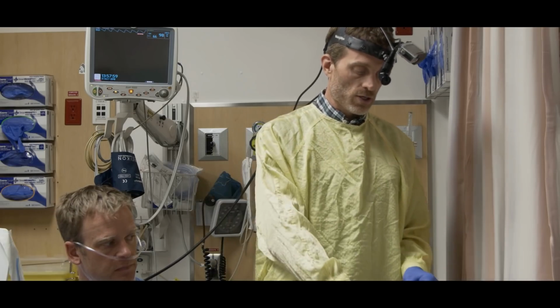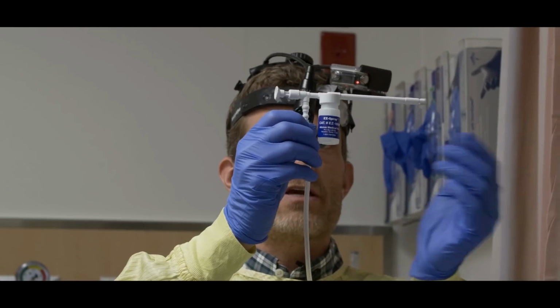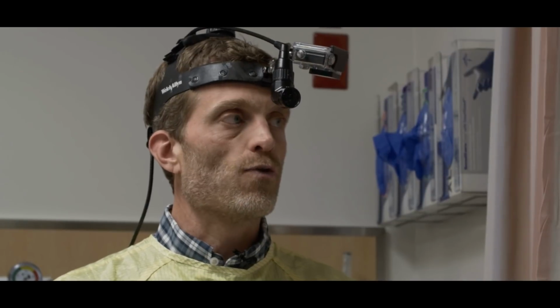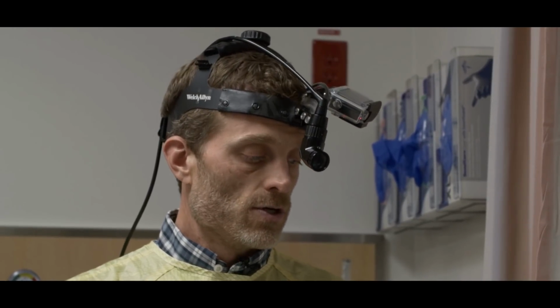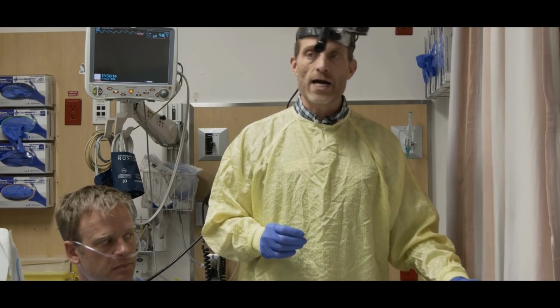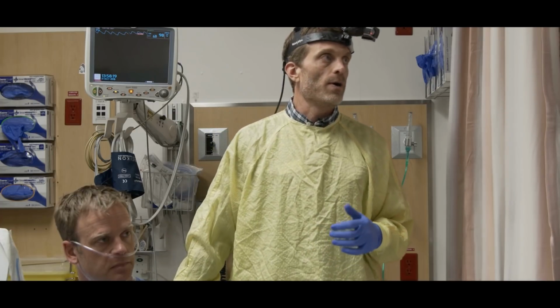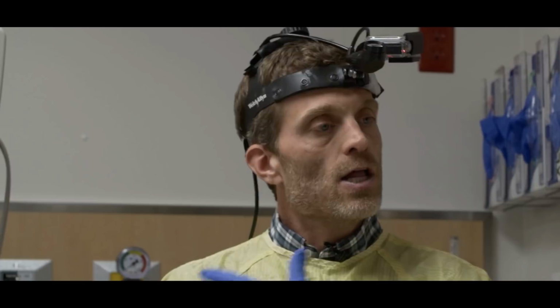And then we used, how much of this did we use? We started with 10, and we have about 6.5 left. So let's say even 6, so that means we used 4. So 4 times 40 is another 160. So we used 320 milligrams. Correct. 320 milligrams total dose of lidocaine. Toxic dose of lidocaine when it's applied to mucous membranes, we don't actually know. But certainly Chad's 80 kilos, so that's 4 milligrams per kilogram of lidocaine he just got to generate the view we just did. Lots of room for additional lidocaine, again, to freeze up the epiglottis itself, direct spray with the atomizer to spray the cords.